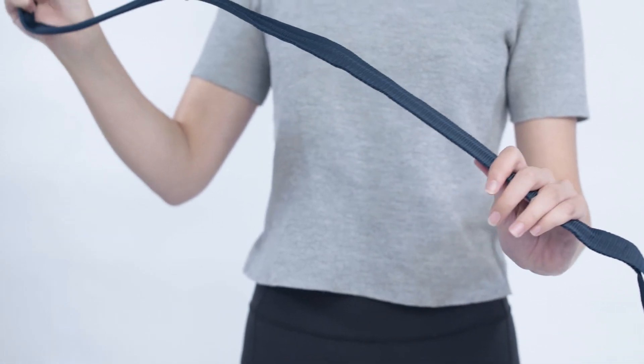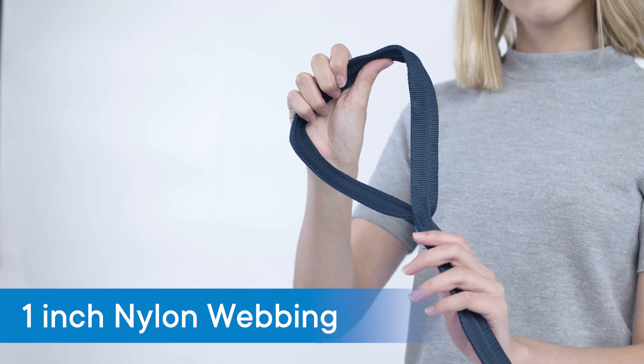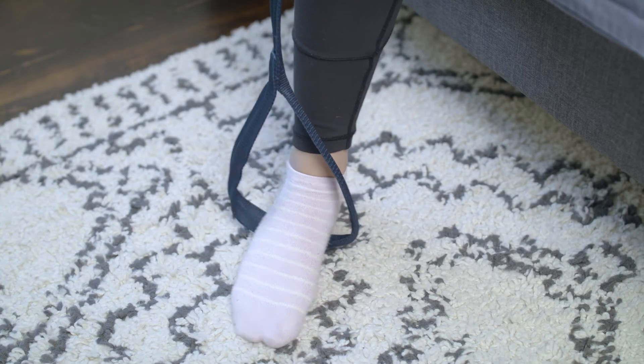The leg lifter contains an aluminum rod wrapped by one inch nylon webbing which remains rigid, strong, and durable through repeated use. It is ideal for those with limited mobility as well as those recovering from injuries or surgery.